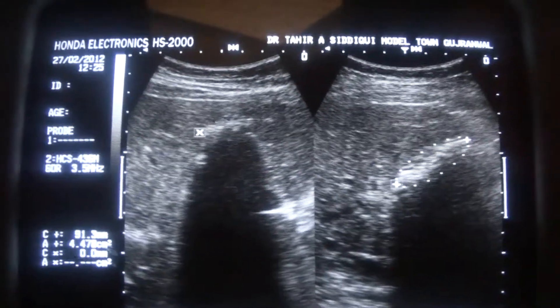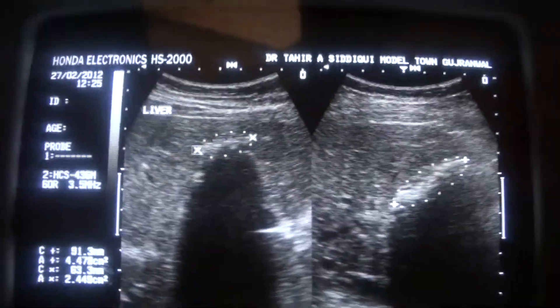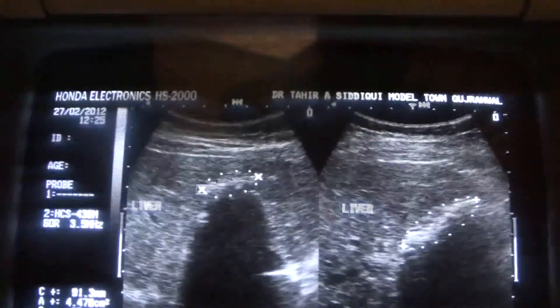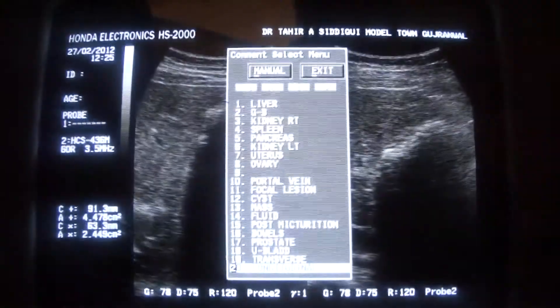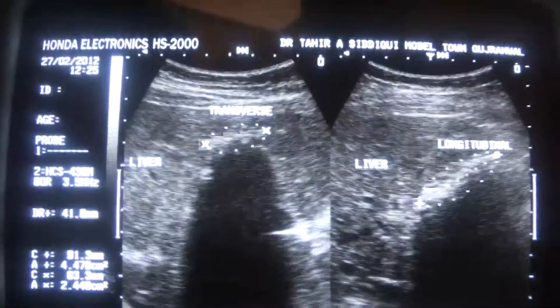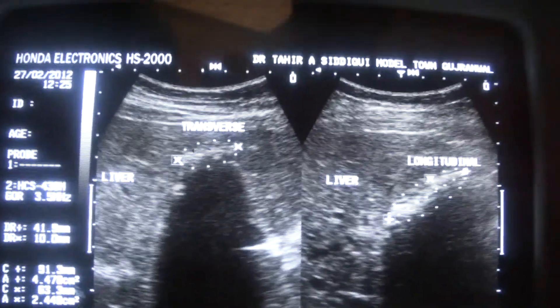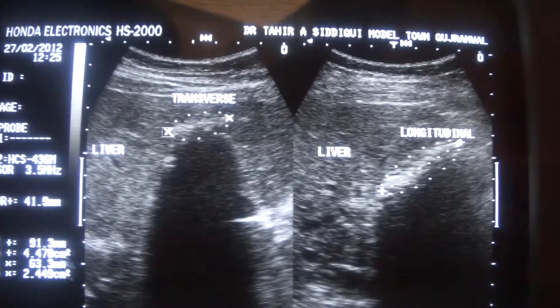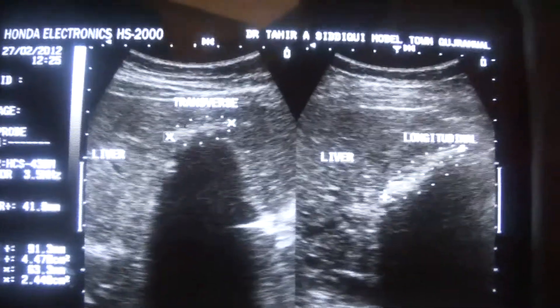These two areas appear to be within the liver. This is the liver in transverse, and this is the longitudinal section. It measures 4.1 cm in length and 9.6 to 10 mm in anteroposterior diameter. Now, is it a calcified granuloma or calcified lesion? They will give the same picture on ultrasound.